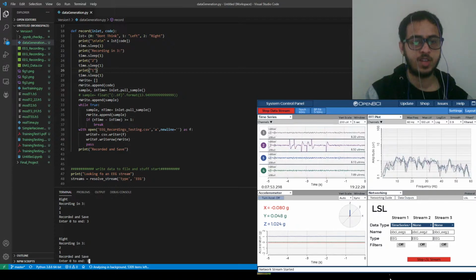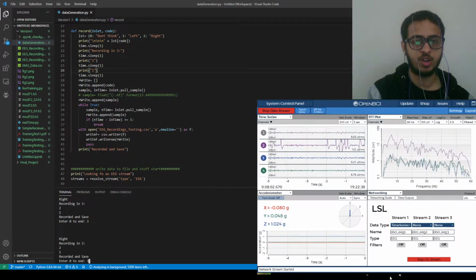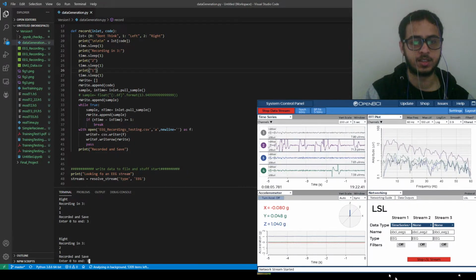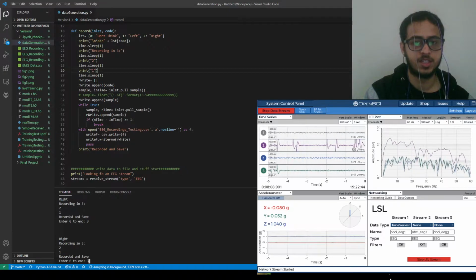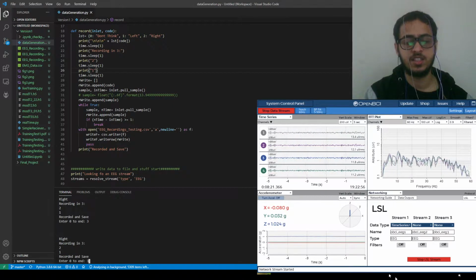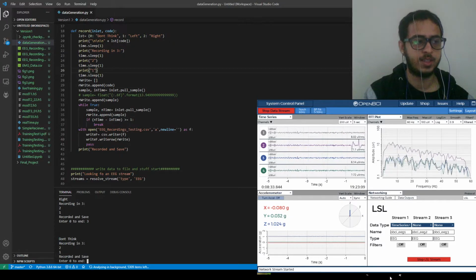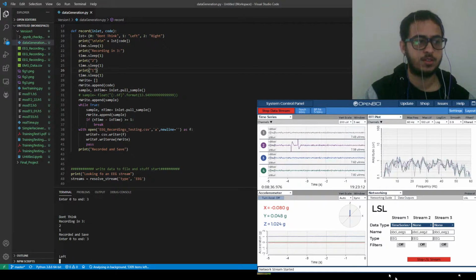But during training, even if I record these thinking processes, left and right, individually, I process them together as either thinking or not thinking only, not as left think, right think, or don't think, just for initial simplicity. So let's go again. Currently we have three right recordings, but each time it generates right or left in a random fashion. So don't think, and try not to think anything. Similarly for left.